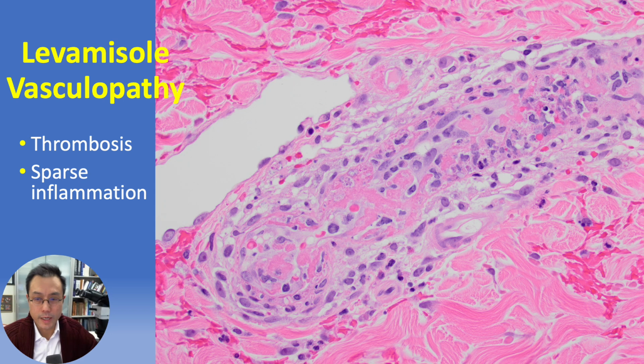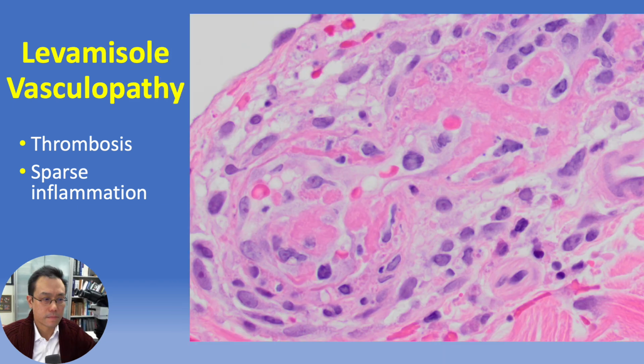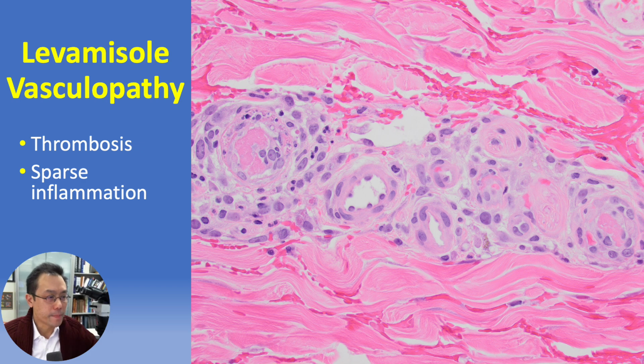occluding vascular lumina, with prominent fibrin and presumed endothelial necrosis in a profile of necrotizing vasculitis. And the changes can be somewhat focal, with occluded vessels juxtaposed against either adjacent or other sections of the same vessel, apparently unaffected, thrombosed.